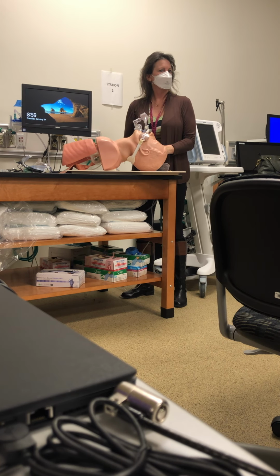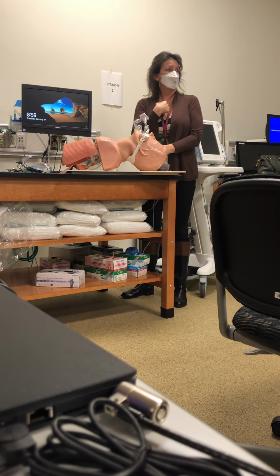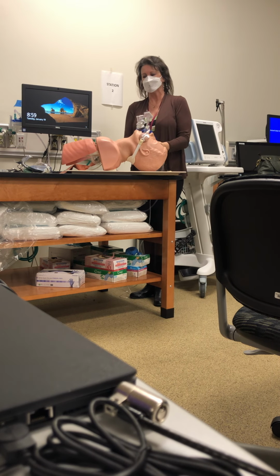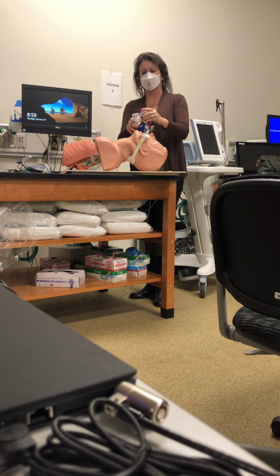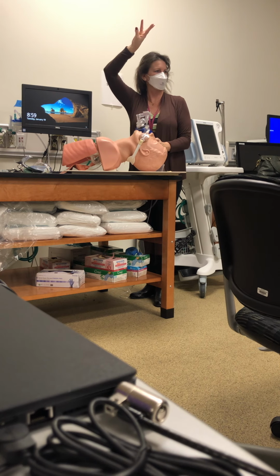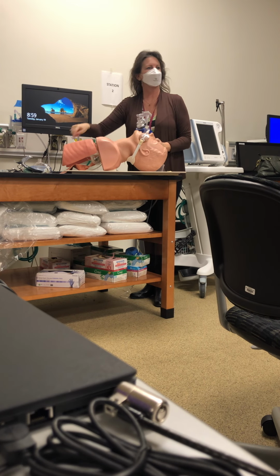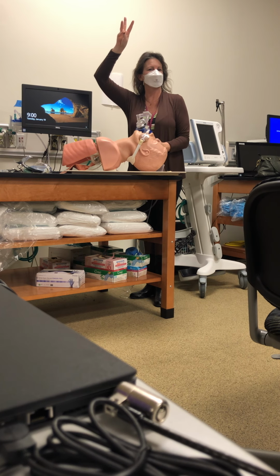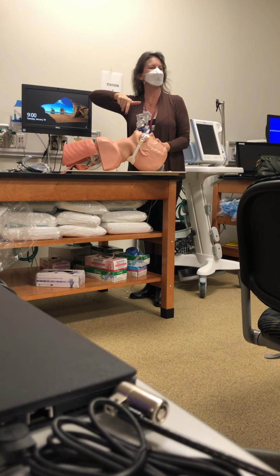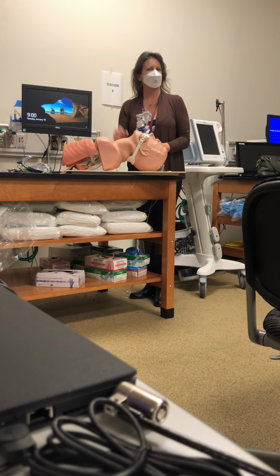Anybody have a stethoscope? Do you want to listen to breath sounds? You want to auscultate, right? This is all on you. Everybody's depending on you. So you're bagging and you grab your stethoscope and you listen in 3 places. You're not doing the full assessment, 6 places. You're listening in 3 places. Tell me the 3 places that I would listen to make sure that that tube is in the trachea, not the esophagus. Tell me 3 places.